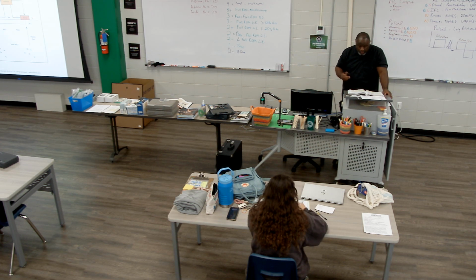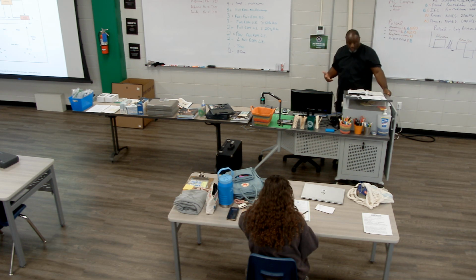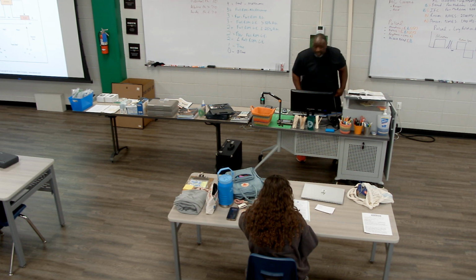Small accumulations are actually advantageous because they help with things like wound care and fracture healing. So we use direct current conceptually to deal with wound care, delivery of medication, or fracture healing. So we don't do fracture healing. It's done from a physician's office.